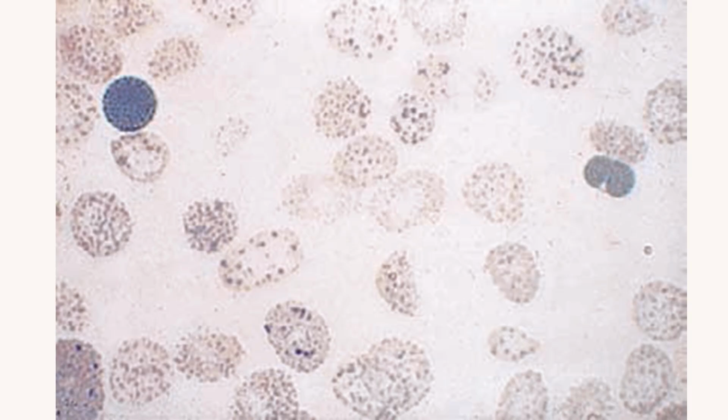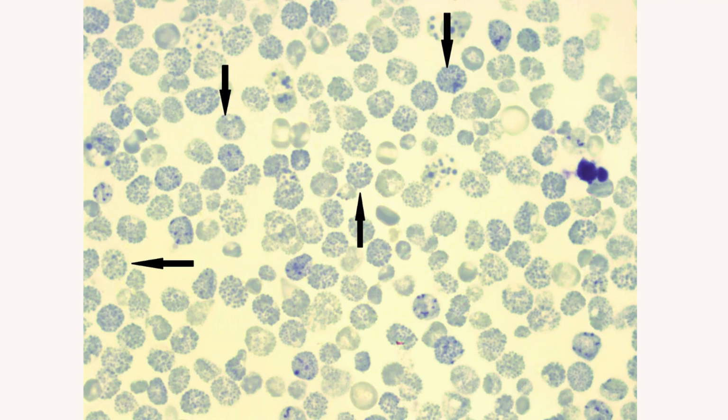The H bodies stain a bluish green in color, in contrast to the blue purple of the reticulocyte. The results are reported as positive or negative for hemoglobin H bodies. In another picture, you can clearly see the golf ball-like appearance of the hemoglobin H inclusions in the red blood cell.